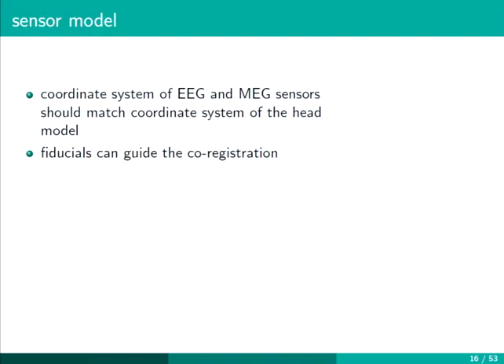And these fiducials can also be used in the EEG and MEG recording, so they will be recorded as further electrode positions. So we can match the fiducials that we got from the MRI and the EEG or MEG recording session. In this tutorial, as we have CTF MEG data, we will co-register the MRI and the EEG sensors in the CTF coordinate system.